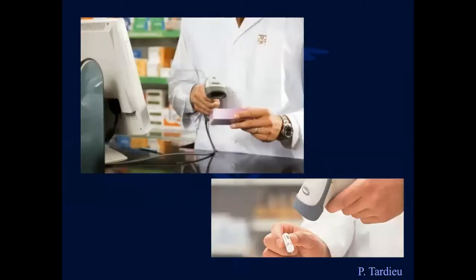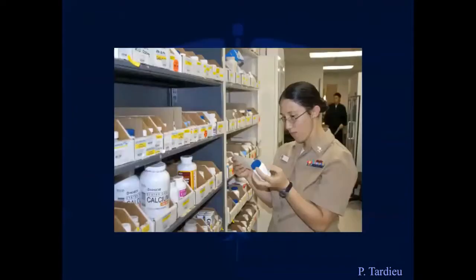In this way, when I have something to note, what it is, this vial for example, I scan it and I don't need to write the reference number, the lot number, the manufacturer, the vendor, and all that. This is all implemented in the QR code that they are giving to you. And you can work on all the inventory like this, but also on the pouches, the sterile pouches, as I am going to show to you.